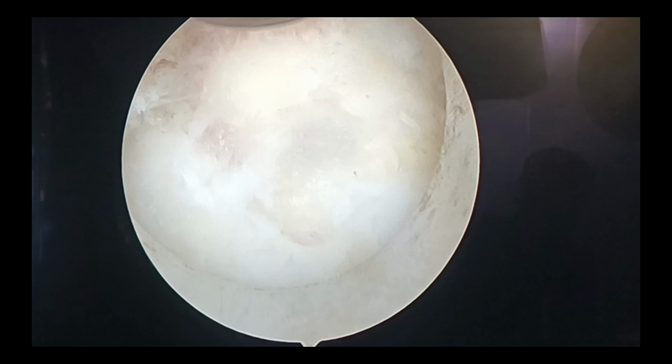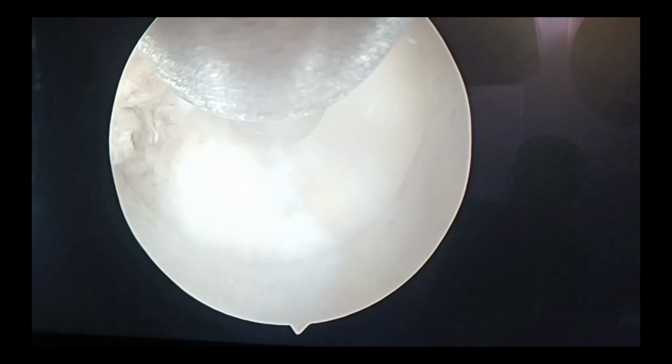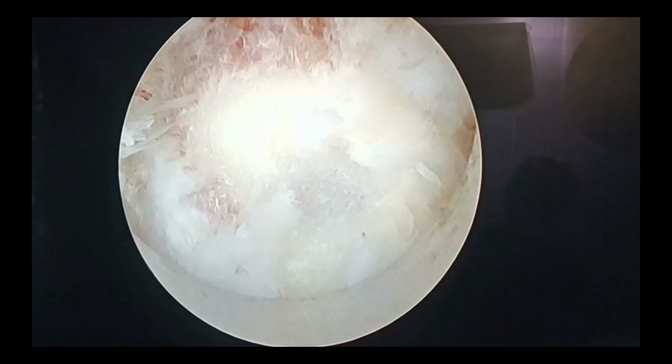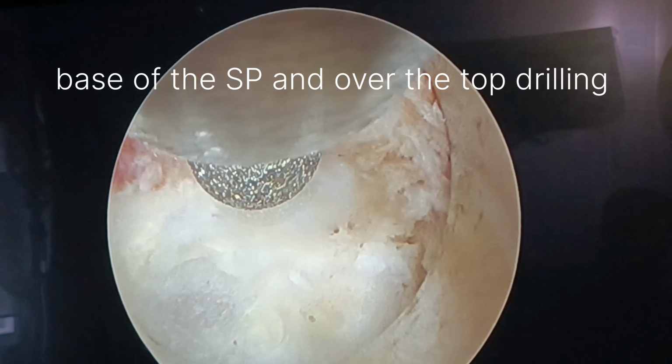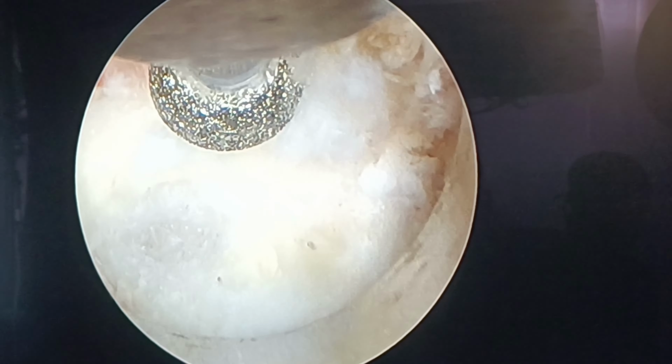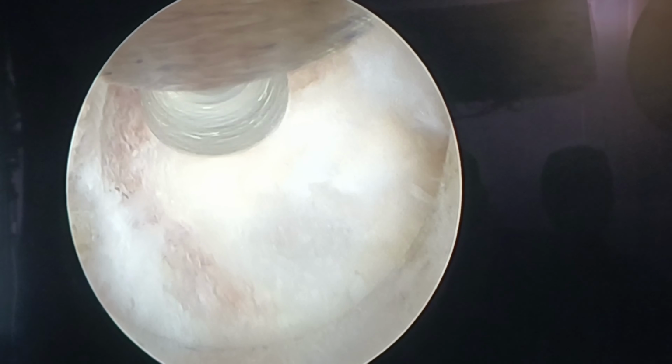I prefer diamond drill because it's advantageous, because soft tissue doesn't get stuck like how it gets with cutting burr, and bleeding is much less, so I can drill faster, because in decompression cases in endoscopy, the majority of work is usually done by the drill. Better the drill, the faster the work and less the struggle.